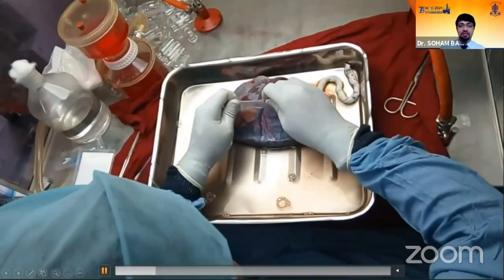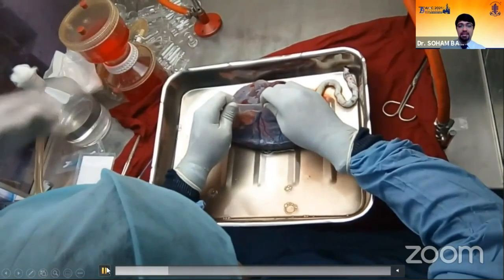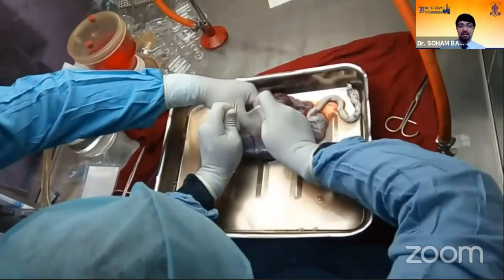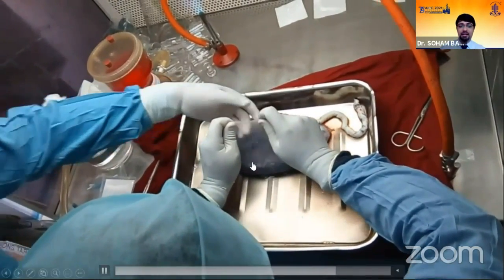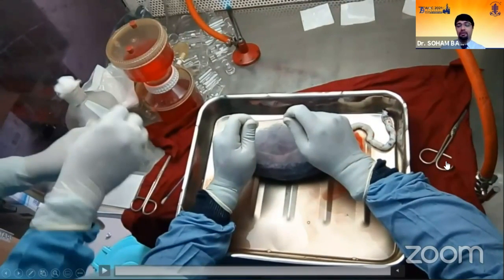Once it is cleaned, now it's time to harvest. Usually we get one of these cleavage planes of the amnion. This is a separation between the amnion and chorion. Once that is done, the other person helps in gently peeling the surface. And here you can see the amnion is separated from the underlying chorionic tissue.